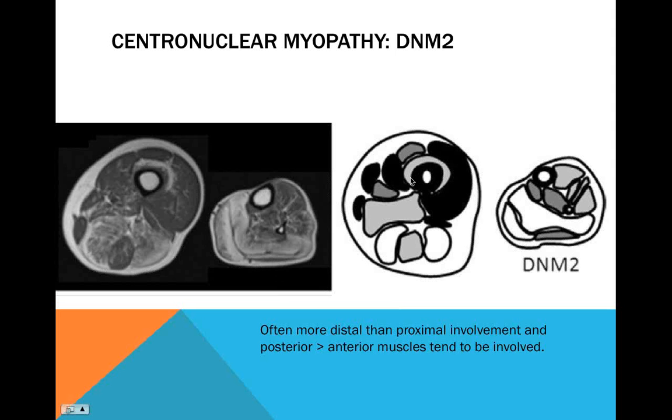There has also been some suggestion, which is not described in this paper here, that the rectus is, well, actually it is subtly described here, but you can't actually see it on this image. And I have to be honest, this has been a description, and it's not something that I have necessarily witnessed. So a lot of this stuff is just something that someone's seen and they've passed along. It's almost like an urban legend until it's been published in a great study. But it's not something that I've necessarily seen clearly on a regular basis.